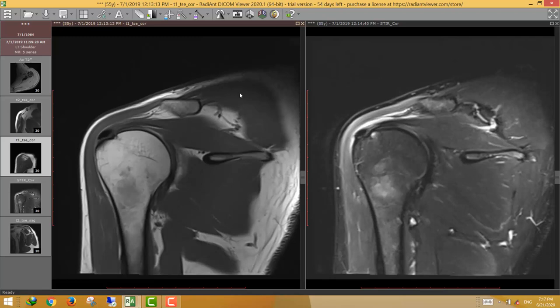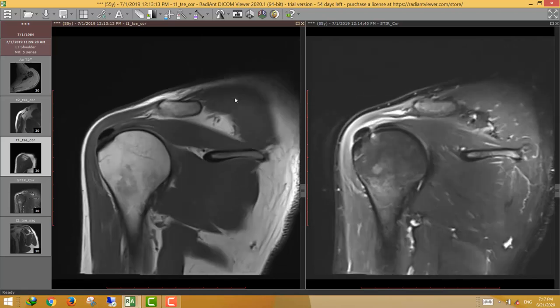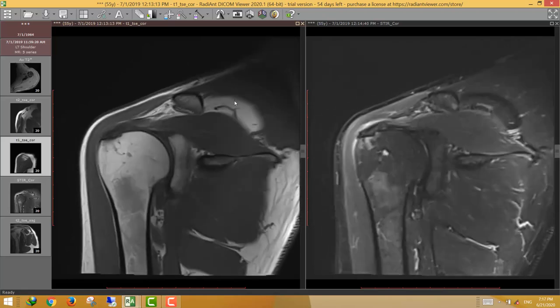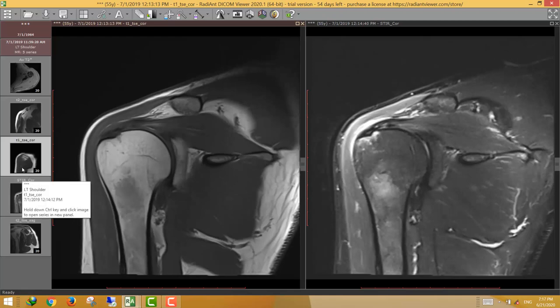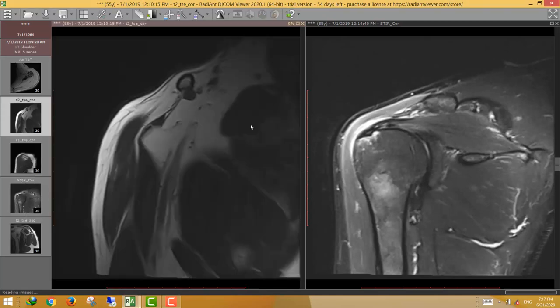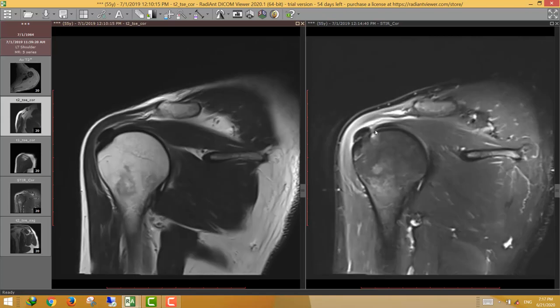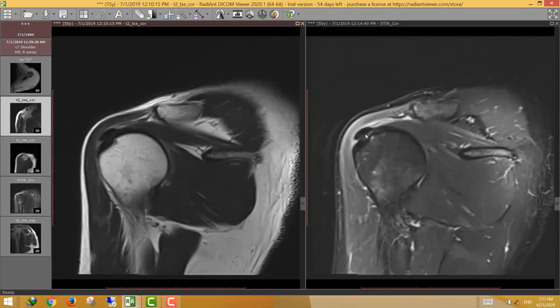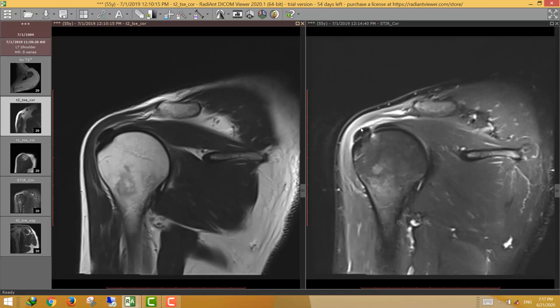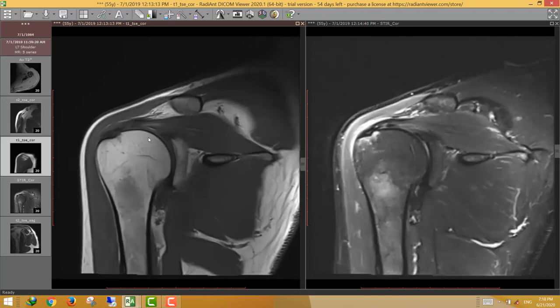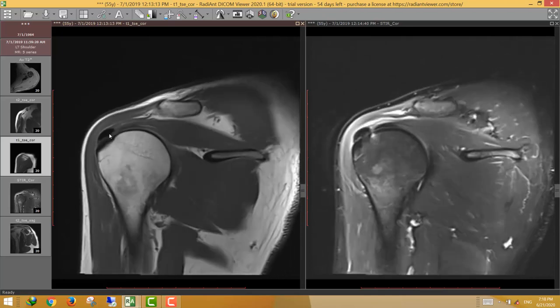The last three cases are MSK cases, much simpler. This is a shoulder case. We can see acromioclavicular osteoarthritis and supraspinatus tendinopathy. There is an area of dark T2 and STIR signal — resistant dark signal on T2 and STIR — and even on T1-weighted images the area is extensively dark, representing calcification along the supraspinatus tendon.